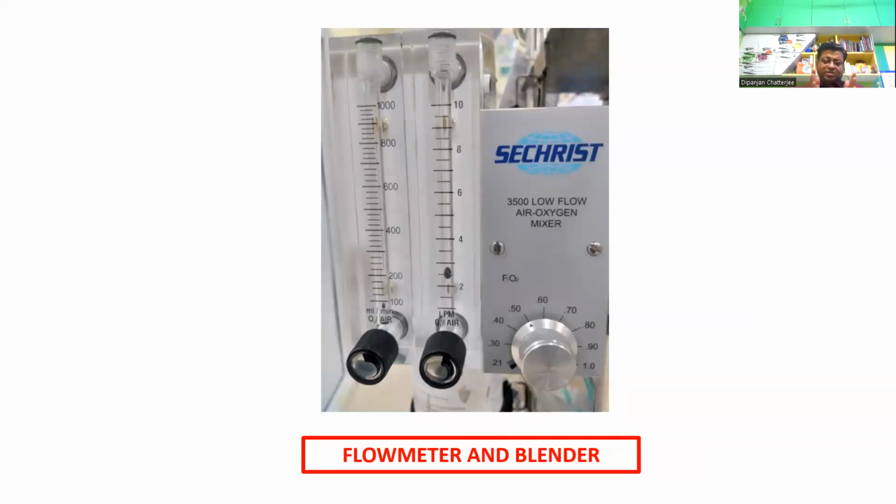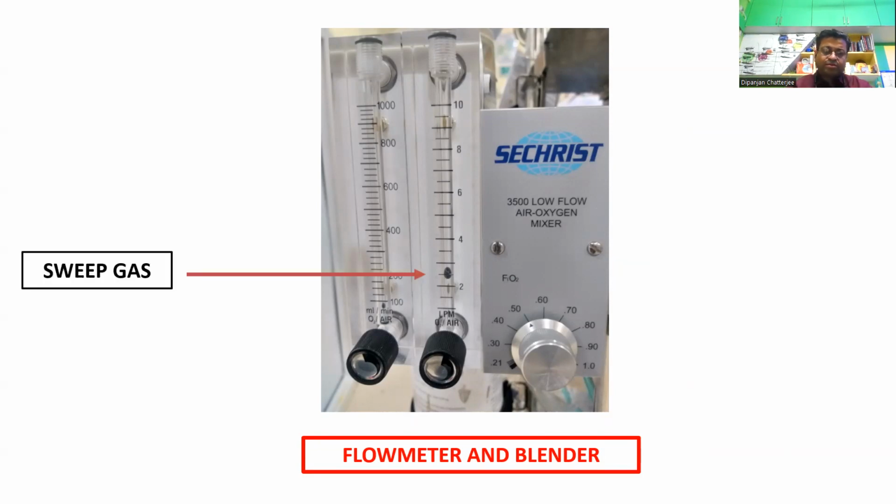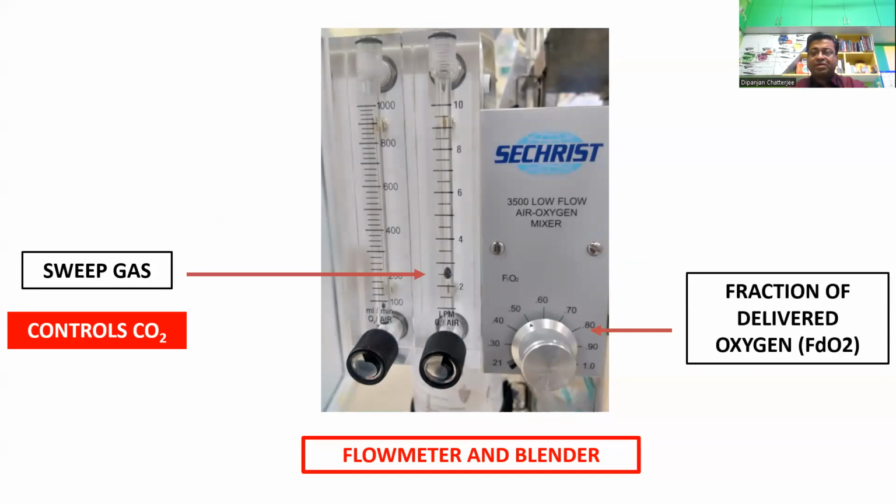So in an ECMO machine, you have a flow meter, that is the total flow of gas that is given into the ECMO membrane, and the blender, which will determine how much is the oxygen content, that's the FiO2 in this sweep gas. So our net sweep gas flow controls the CO2, whereas this blender controls the oxygenation part of the blood.